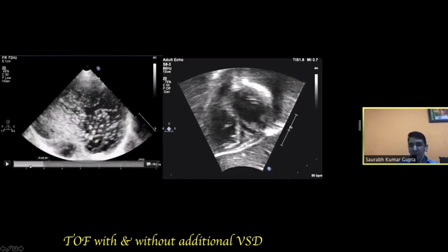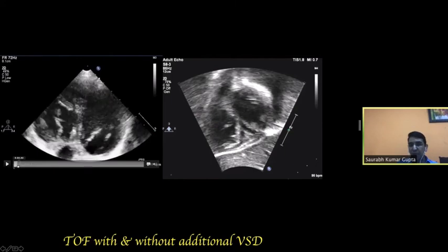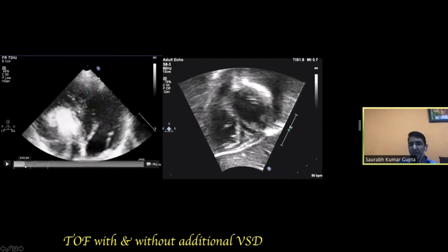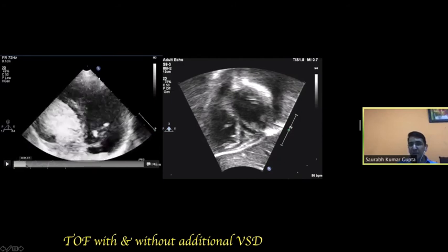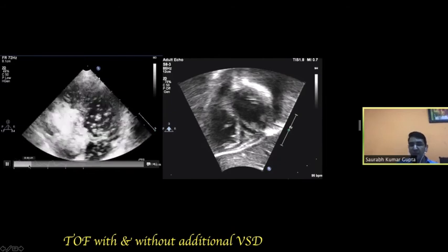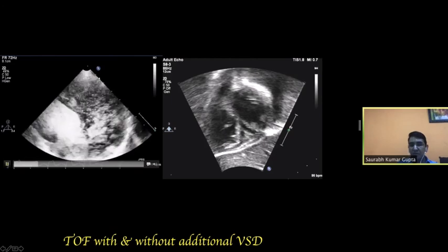Again, we will do our usual assessment of going right from the beginning. You can see over here that there is no contrast in the beginning. Then it comes from the VSD. But if you see over here again, it's not stopping.